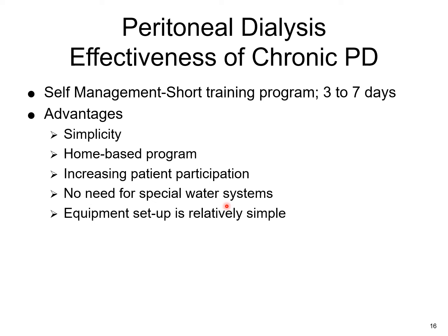It's just literally the pole and the pump. For peritoneal dialysis, you have the pump, and you have a catheter in place, and then you're just connecting the different bags. Essentially, that's all that's happening with peritoneal dialysis.